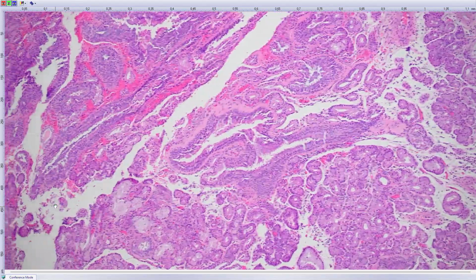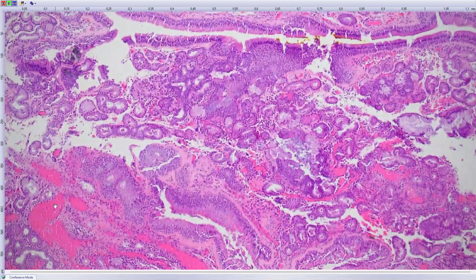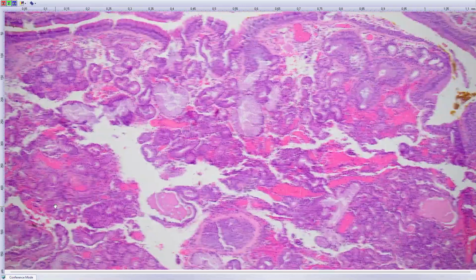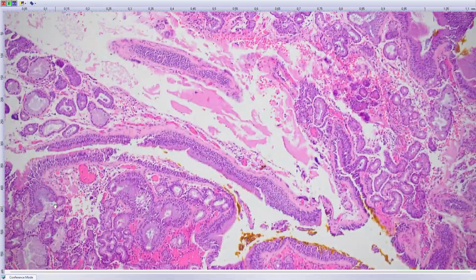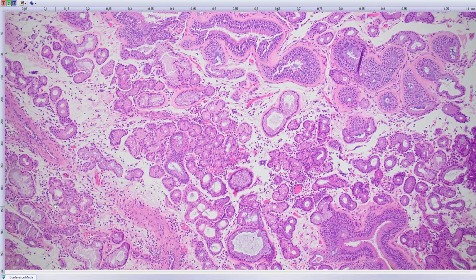But what you see here is either seromucinous hamartoma, like here, or REAH, respiratory epithelial adenomatoid hamartoma. In the seromucinous hamartoma, like you see in the middle of it, we know that these lesions have genetic aberrations, especially some fusions.